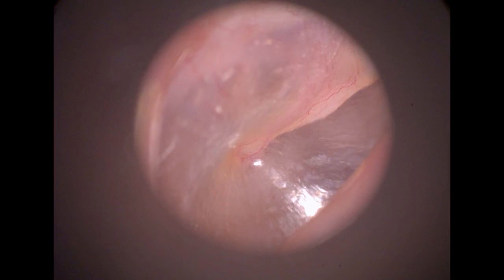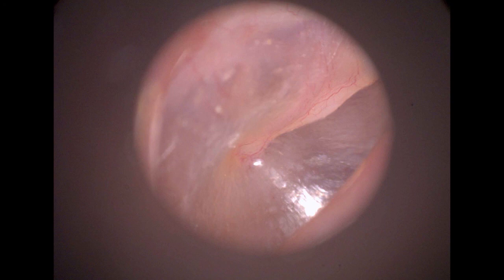As a general guideline, use autofocus when there is a clear view of the tympanic membrane and manual focus when the ear canal is narrow or the view is bad because of a hairy ear canal. When using a small speculum, the image area might not always be completely visible or centered. Use edit capture area function to center the image. It is also recommended to use the zoom function and an increased level of illumination with a smaller speculum size.